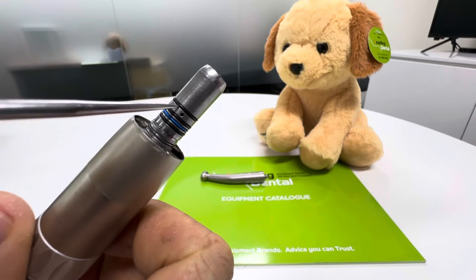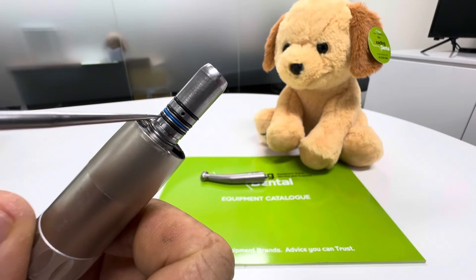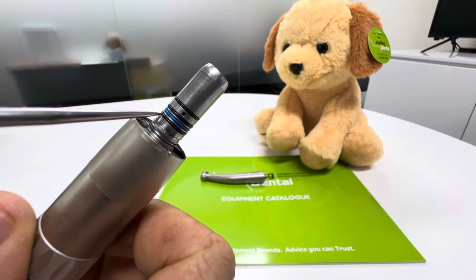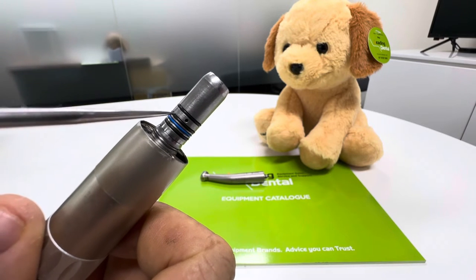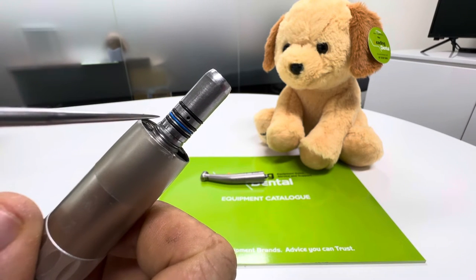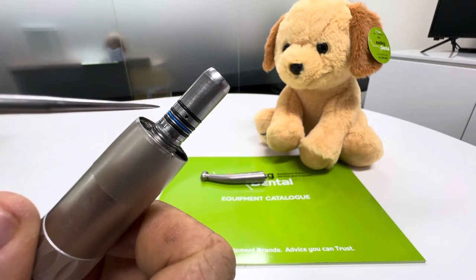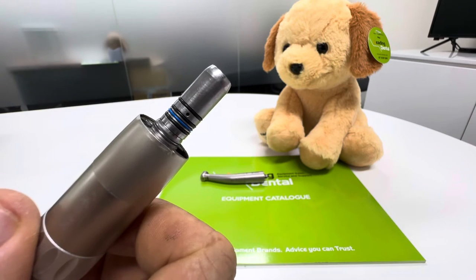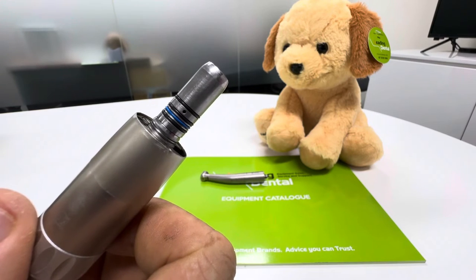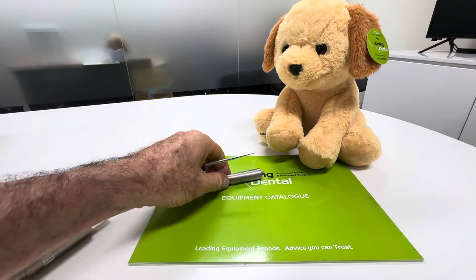You'd get an o-ring pick, or a little hand scaler or something with a nice fine pointer — a little pick to get these off — and then just roll the new ones on. You can put a little bit of o-ring lubricant, something like LubriJet drops, which is a Katani product we sell, or you can use a bit of handpiece oil on those just to keep the o-rings lubed up. So that's the low-speed motors — they're similar with air or electric.